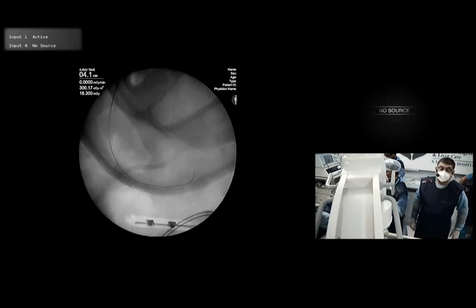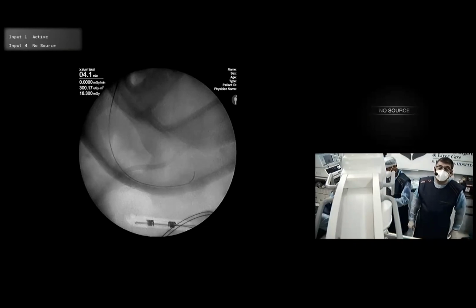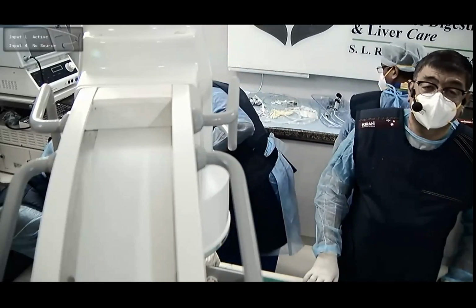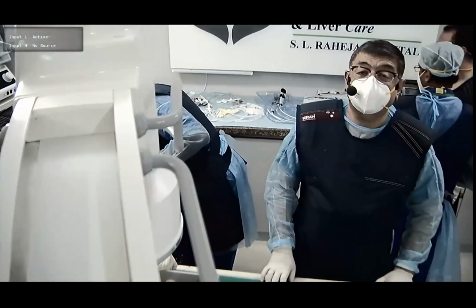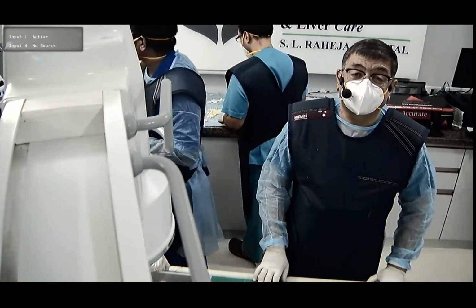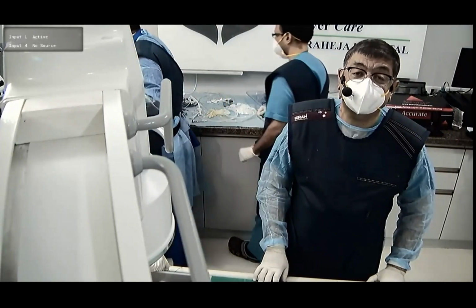I think we are now pretty sure, and I don't remember when my EUS-BD has failed last. But for any endoscopic procedure, I would not try for more than 30-35 minutes. If it doesn't happen, it doesn't happen. And probably you know in the first 10 minutes that it is not going to happen.